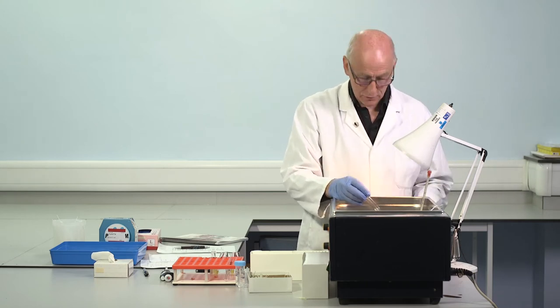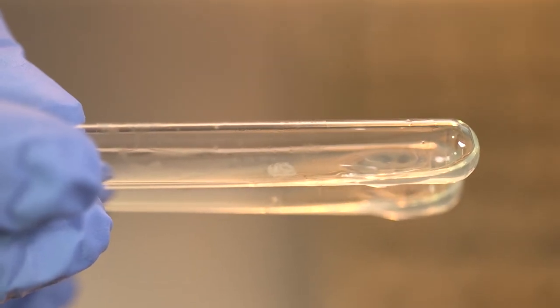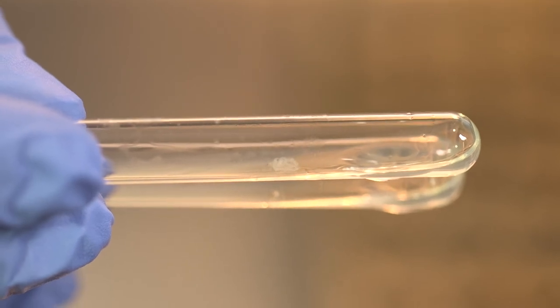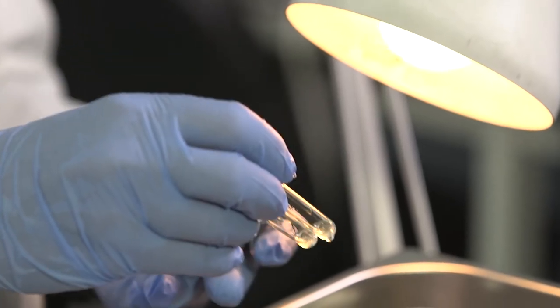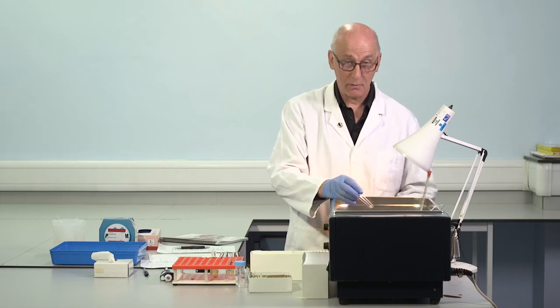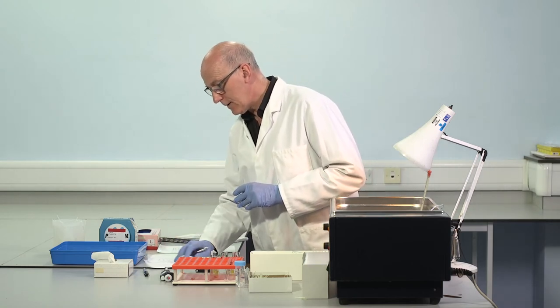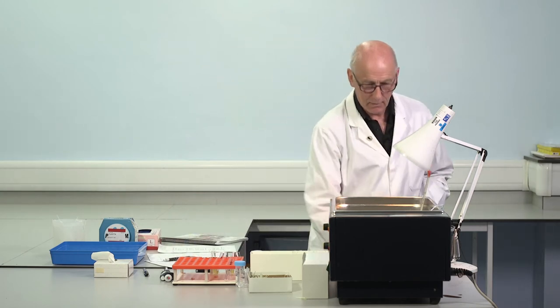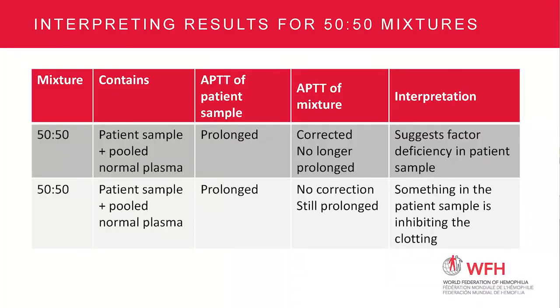This was patient number 4 whilst we're talking. It's a very weak endpoint in this. I apologise that you can't see it, but it's a tiny, tiny clot. And that's typical of a grossly prolonged time. In this case, 147 or 145, so a pretty gross prolongation. Okay, so we know a 50-50 mix without any correction, leaving a grossly prolonged APTT on that mixture, an inhibitor is present.